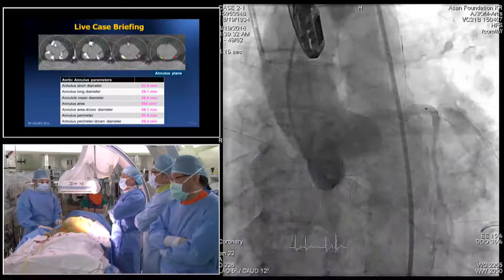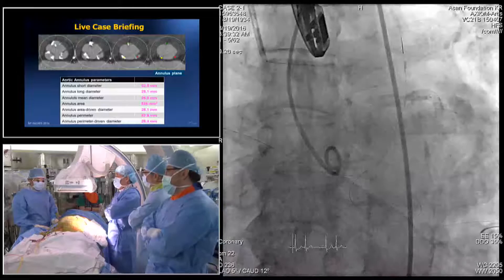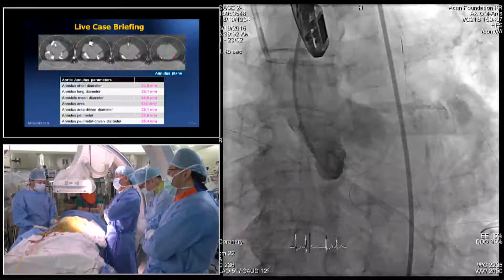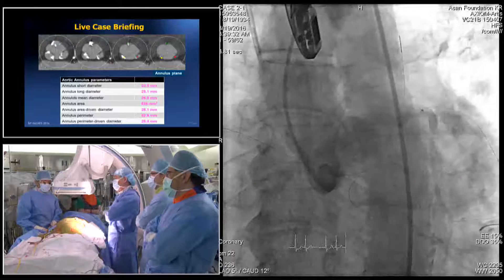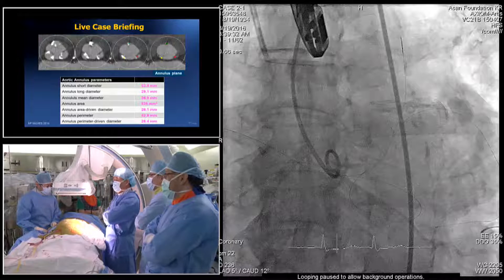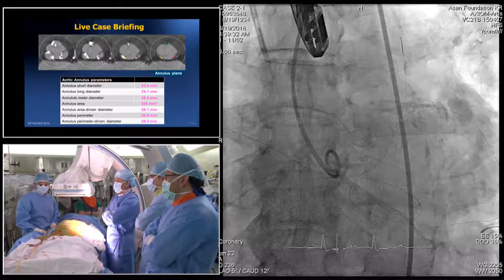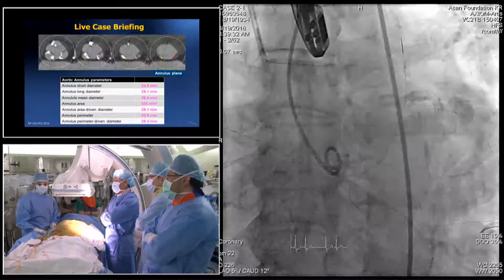My current approach is to reduce the volume a little more to start, because it's easy to increase later. I don't want to oversize too much and cause annular rupture. Even without calcification, if you stretch too much there's a small risk for aortic root hematoma. Knock on wood, I haven't had any annular rupture in 11 years with this approach — I usually downsize a little more and increase volume if needed.